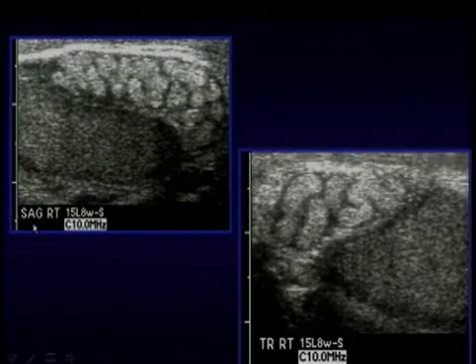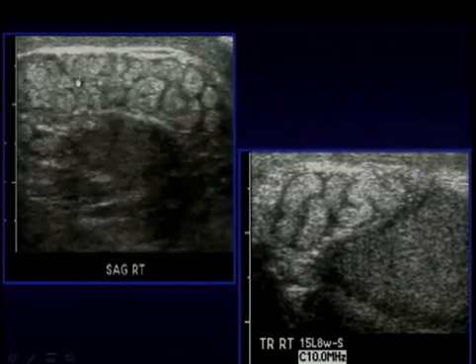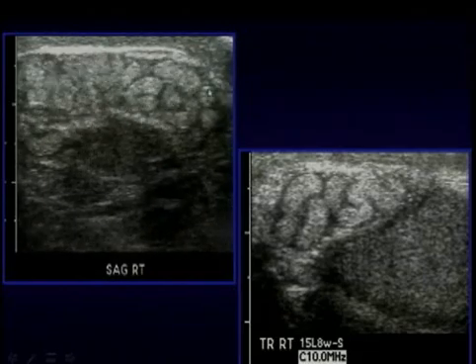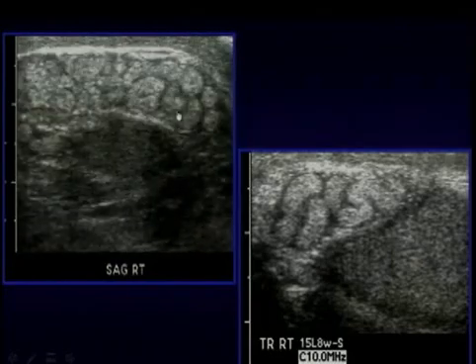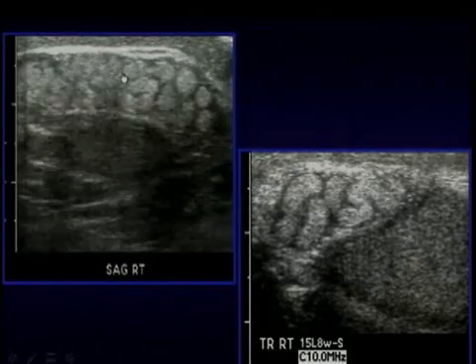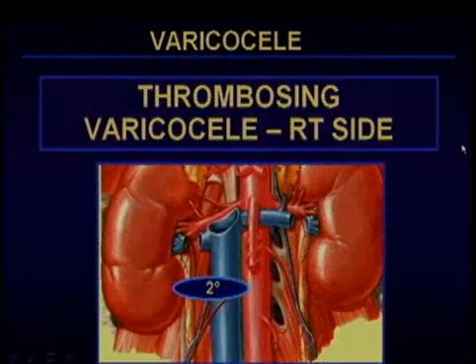This is an interesting case on the right side. This patient noted some thick, rubbery consistency around his right testis clinically, which brought him to our ultrasound lab. When you just put a clip on and turned up your gain, no color needed here, you can see very, very slow flow on the right side. So what does this turn out to be? That was an acquired right-sided varicocele.